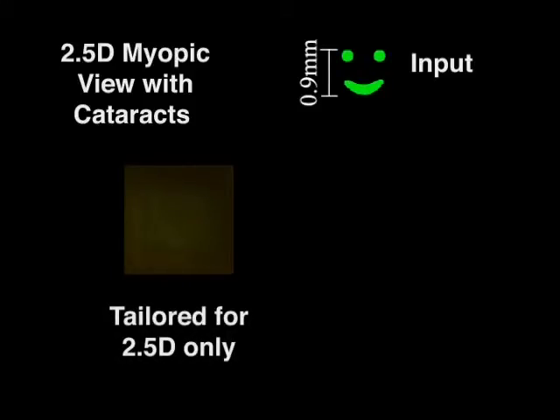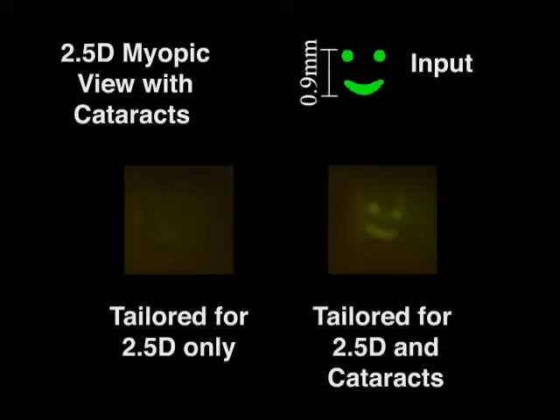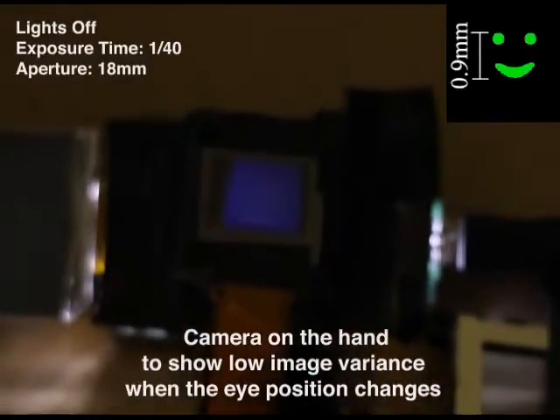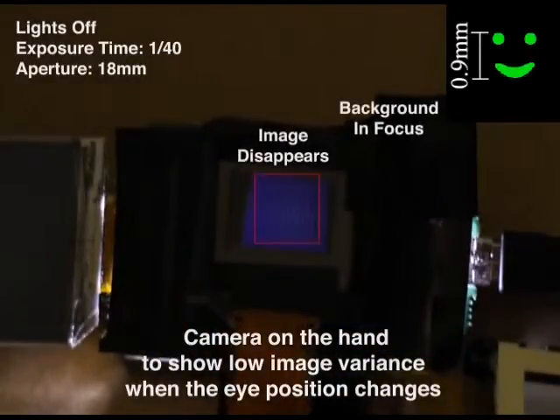Here is another case. A 2.5 myopic subject with nuclear cataracts cannot see the tiny smile, while a tailored display can show him the pattern. In this video sequence, one can see how the pattern changes according to the point of focus. Notice that the pattern is only visible when everything else is blurred.